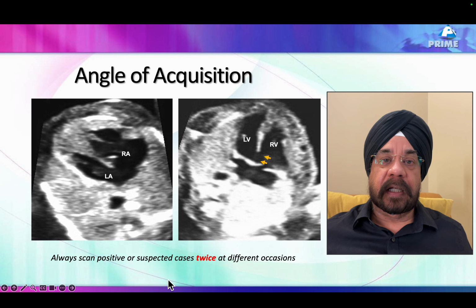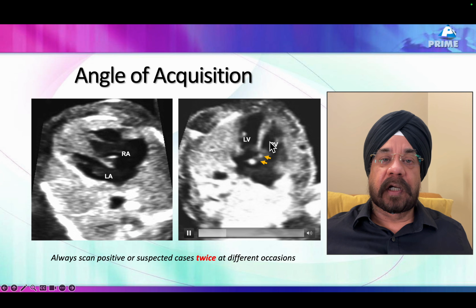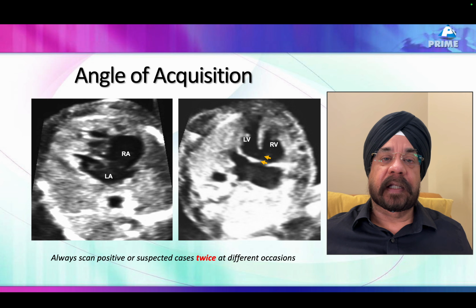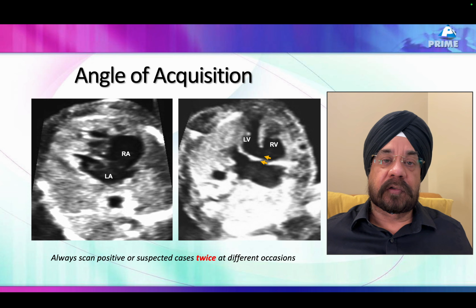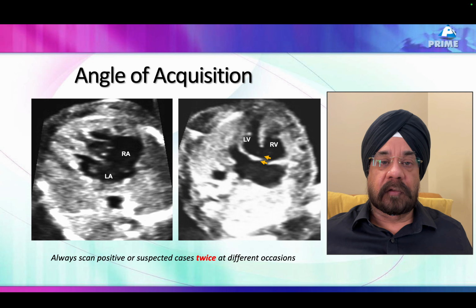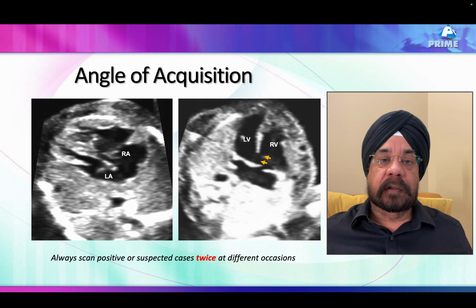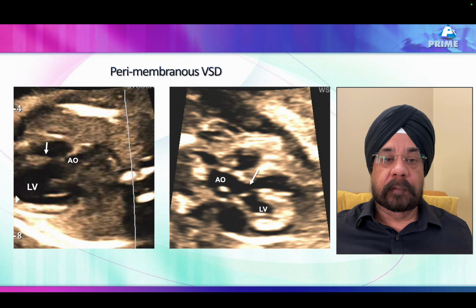But the moment you see an apical 4-chamber view, you see there is a large ventricular septal inlet defect, and there is a large ostium primum defect, and that actually makes it a common AV canal defect. The entire scenario has changed. Now you have a common AV canal defect, the counseling, the outcome, everything is going to be different. The association with trisomy 21, it all is going to be a new dimension which is going to open.